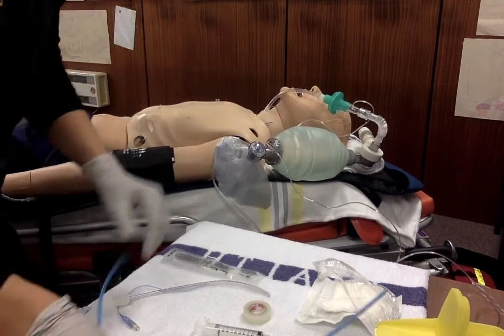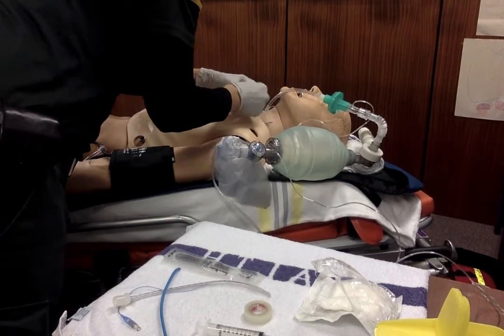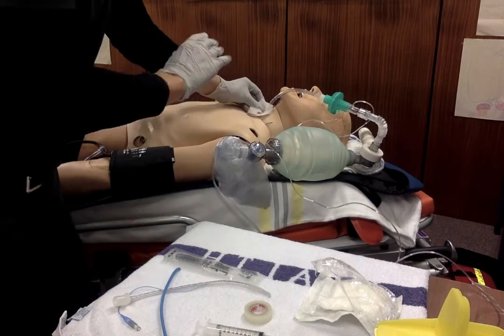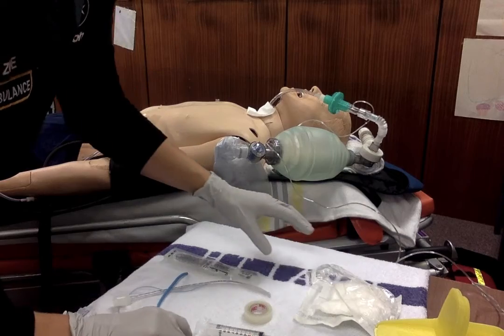Once you've got it secured, you can give it a bit of a clean up because it's probably going to be a little bit messy. You can cover it if you want to, but you shouldn't need to. Hopefully it's nice and clean.